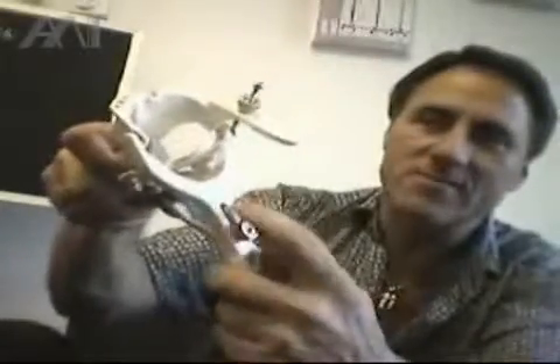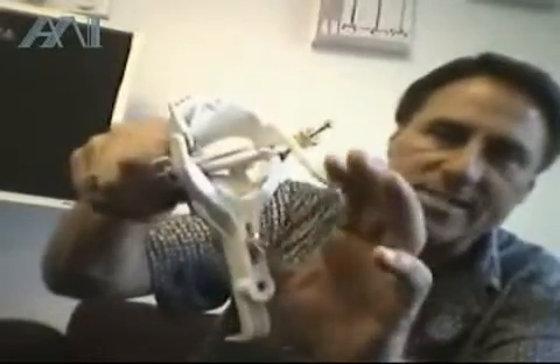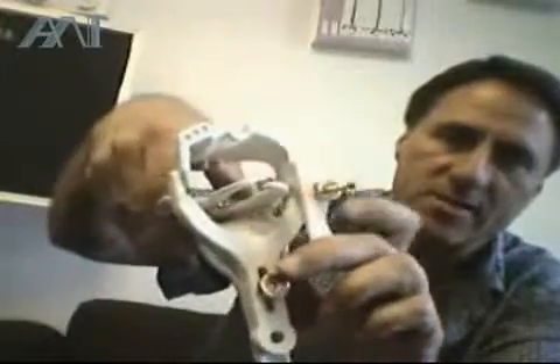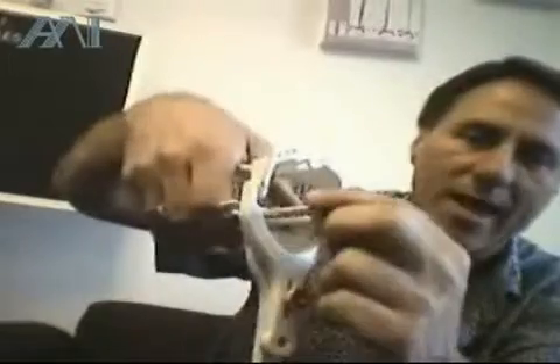Usually the surgeon has two hands, but I'm using one hand as a receptacle of the speculum. The second step is the vertical adjustment by the vertical blade, and finally the side blades need to be activated.